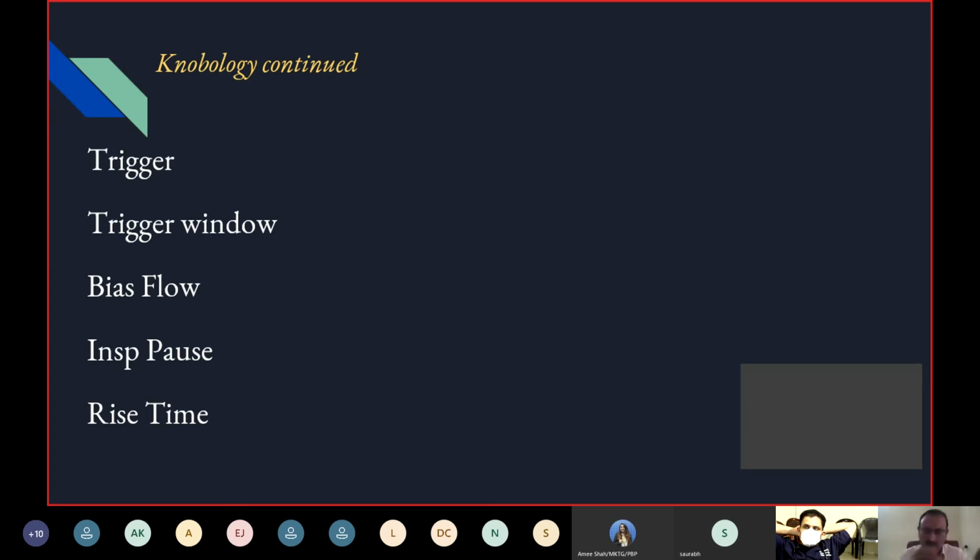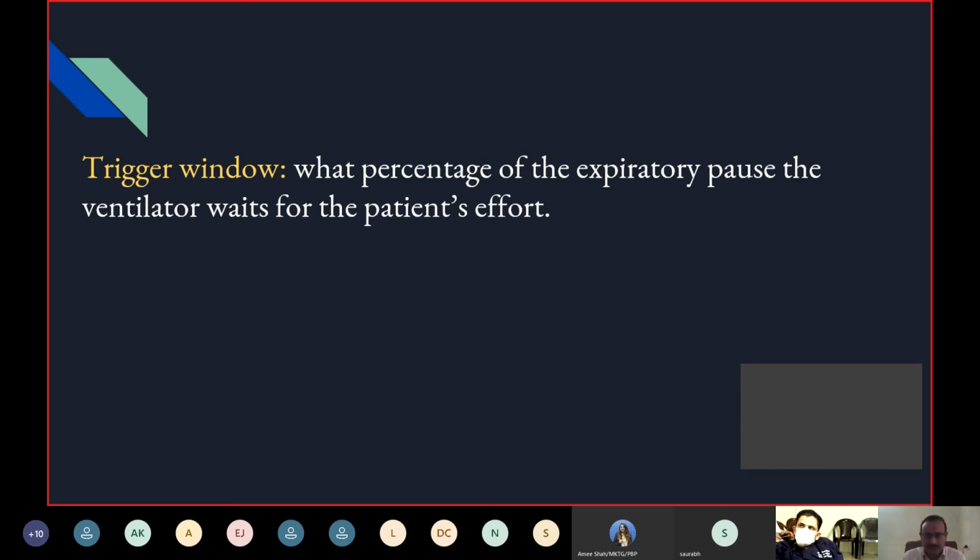So that is why you should actually look at the patient as well. Each time you set it, you should look at the patient. You can look at the oxygenation, you can look at the carbon dioxide, we all do that. But along with that, look at whether the patient is synchronizing with the ventilator. So sit there for some time, do some adjustments. Nothing grossly is going to happen by doing fine adjustments. Play with these knobs. Then what we did is reduced from +2 to +1, and with that flow he was fine.